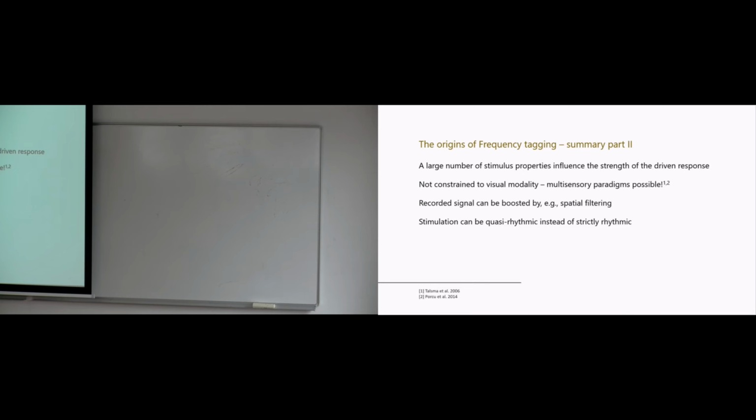Maybe you covered this in the fifth part, but is the power of the response to this stimulation different in different individuals? For example, in low frequencies we have individual alpha frequencies, which is something like a fingerprint of a specific person. The response to specific frequencies may also differ, and it could be related to these individual frequencies. Is there some research on this?